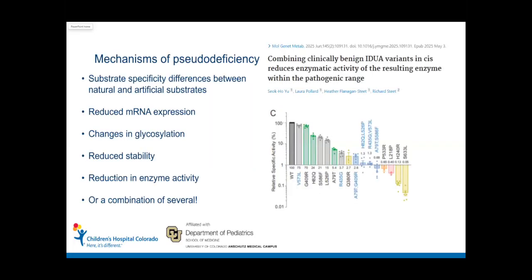One of the other things I want to talk about again is this mechanism of pseudodeficiency. There's some early literature to suggest that this was sort of a lab problem and that it's not really a biologic phenomenon. And I'd like to put out there that I think we've got a whole bunch of these alleles, and that may be part of it.